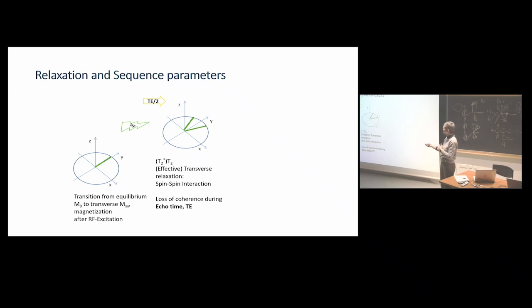And when we actually observe this magnetization in the end, the signal we will get will depend on the vector sum of all these hydrogens in there. So by changing a sequence parameter, which we know as the echo time, we can let these fluctuations evolve. We can observe them as they happen. And that gives us new contrast.